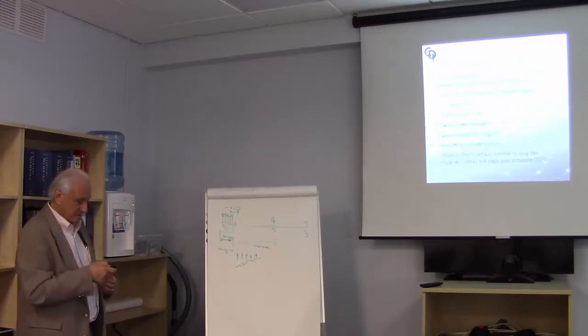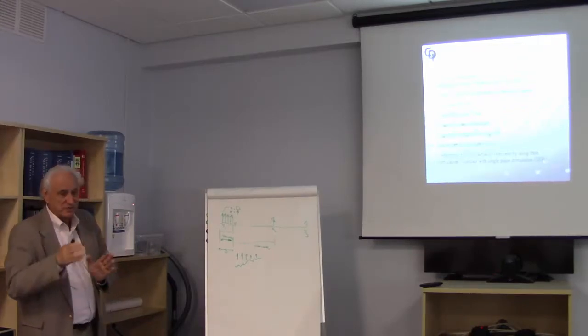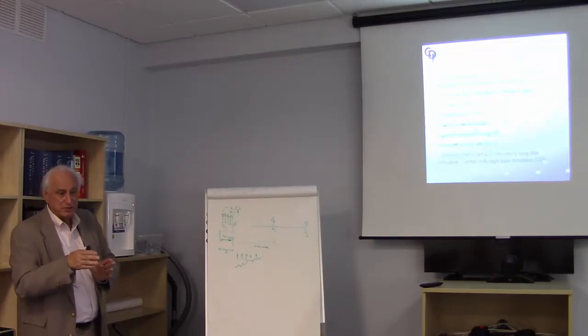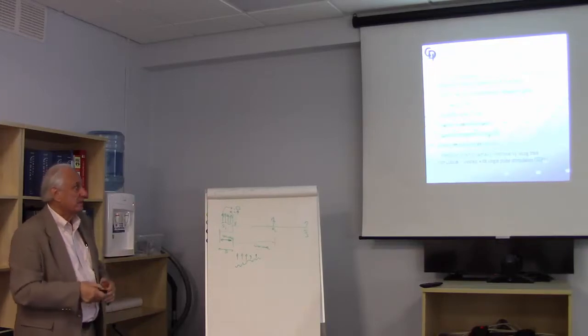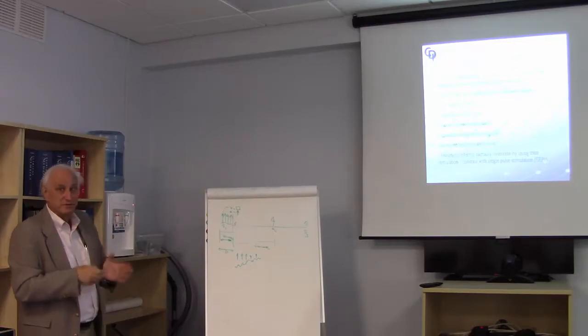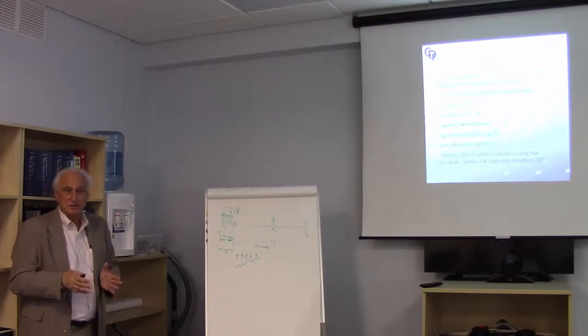So the protocol we've worked out with the anesthesia team we work with is that, as I mentioned the other day, we'll start at a MAC of less than 0.5%, and then we'll titrate it either up or down, recognizing the fact that the MAC is just the group statistic, and you've got to find out where that individual patient is at. We would prefer, if we could do this, to just do TIVA. So, totally intravenous.